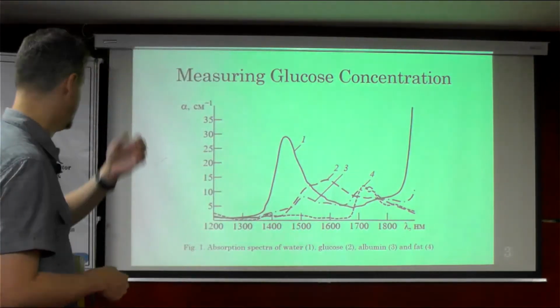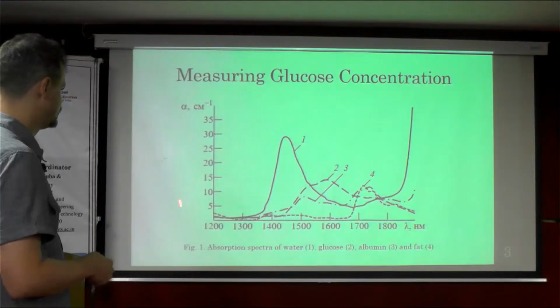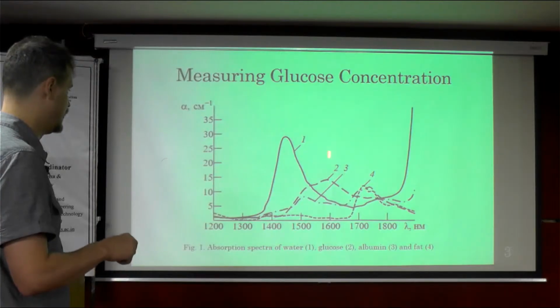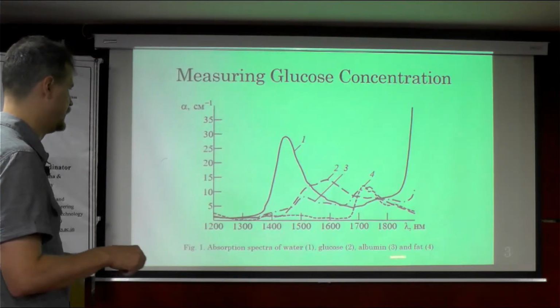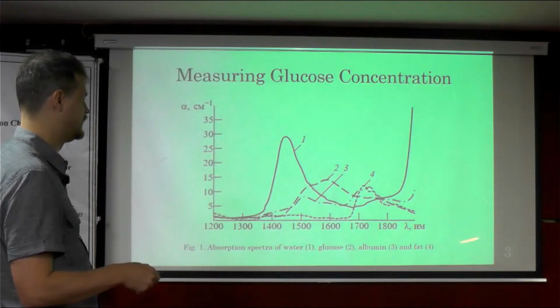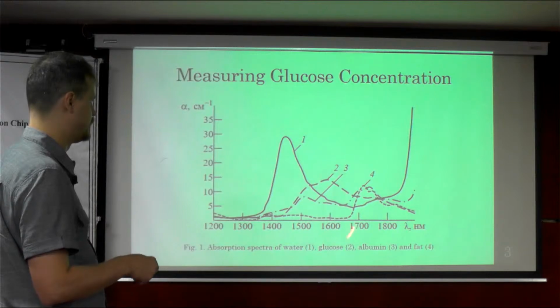There is an optical approach that relies on the change of the absorption spectra of glucose at a certain wavelength that does not experience any interference from other substrates that can disturb the signal from the glucose.